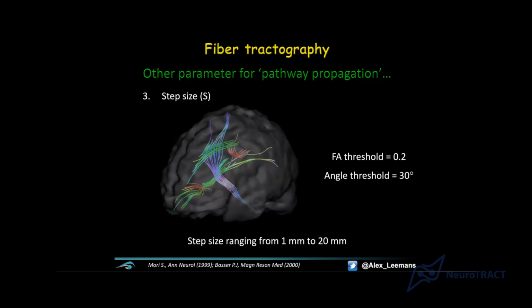In the olden days, you took a picture and it looked really coarse, like blocky, right? Nowadays, a good digital camera, when you take a picture, the resolution is really high, meaning you can zoom in and you can still see all the detail, right? Well, with diffusion MRI data that we acquire of the brain, it's important to have good resolution, to look at fine details. And obviously, the higher the detail, the more that you can look at.